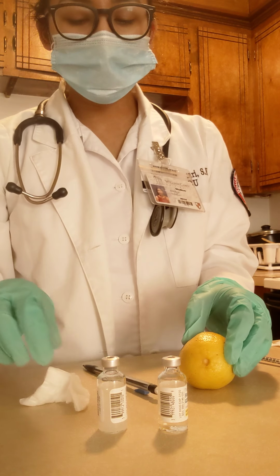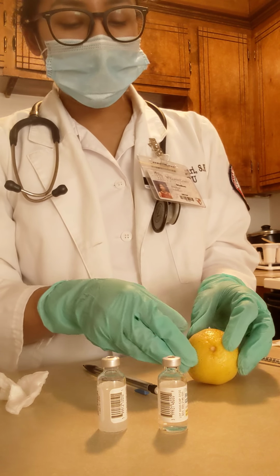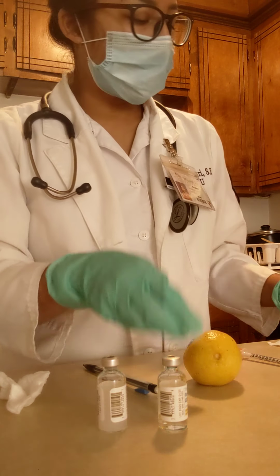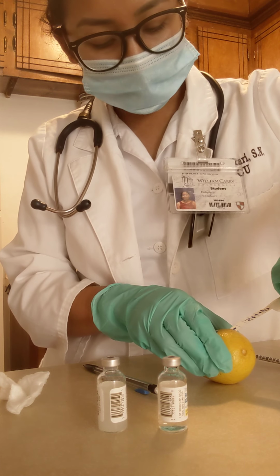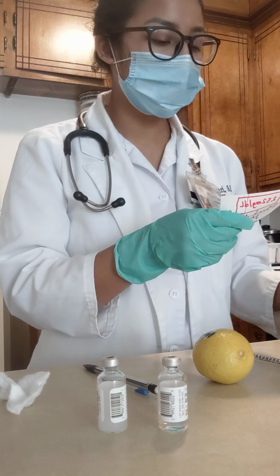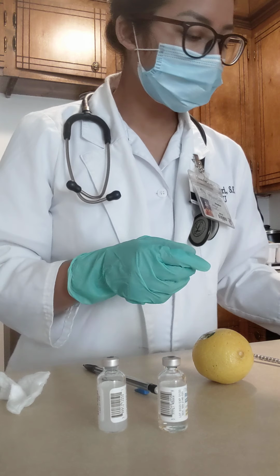Now I will discard the first blood that I got from the prick, and now I will squeeze his finger a little bit to get more blood, and then I take that blood and put it on the strip. I'll make sure that the blood has wicked the strip, and I got a reading on my monitor. The reading is 252 mg per dL.